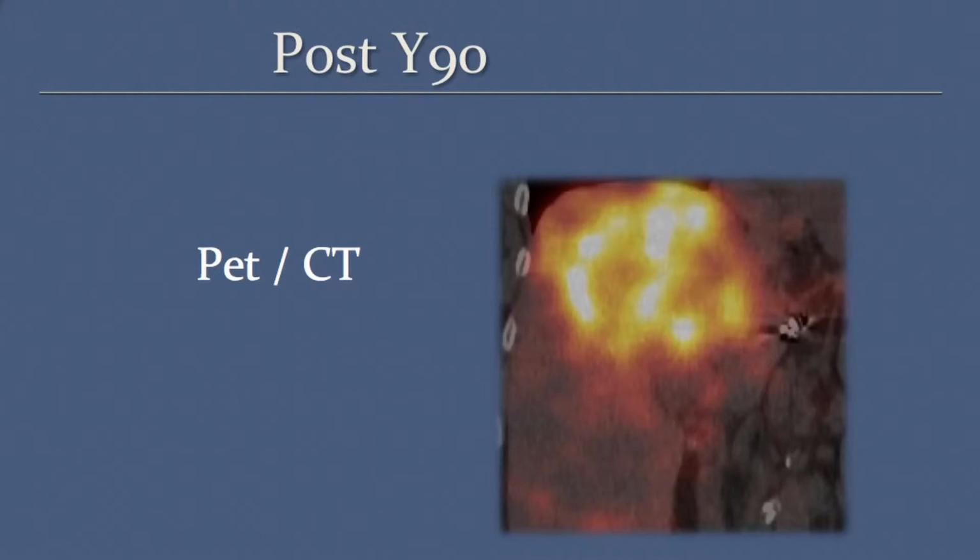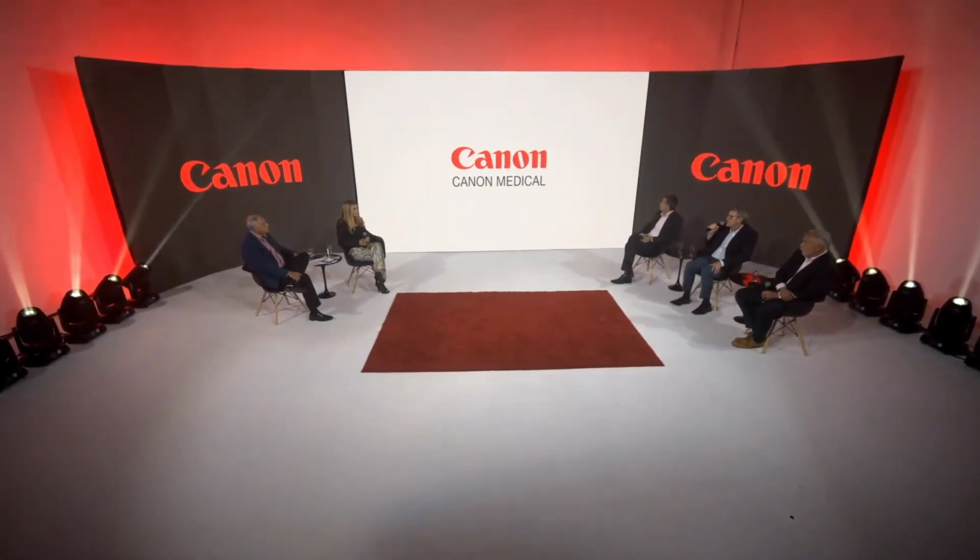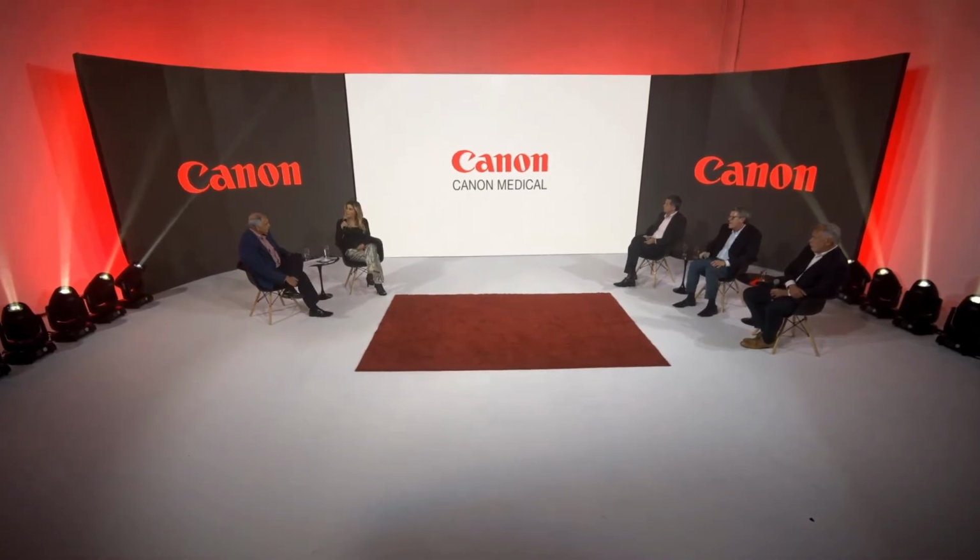And this is the last image, the PET-CT, showing the spheres within the tumor, and they will issue radiation and treat the tumoral lesion, and the patient will have an image follow-up, so we can see how the tumor behaved with the treatment. This is what I had to present.